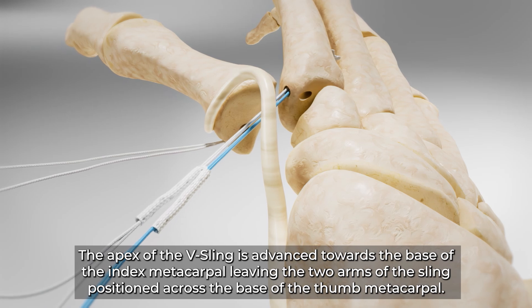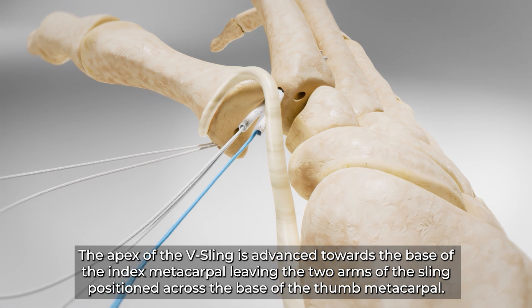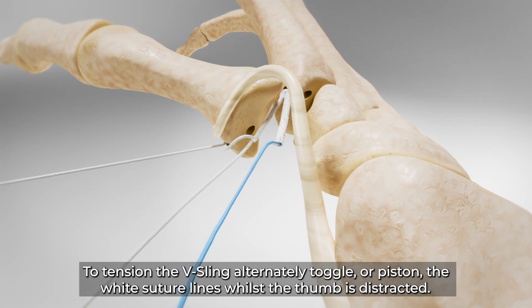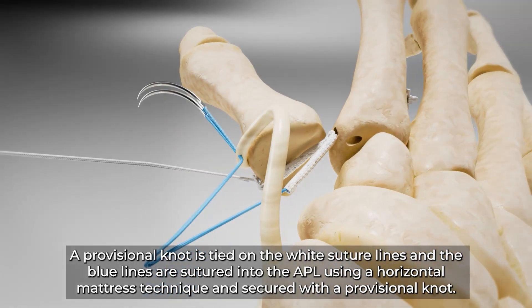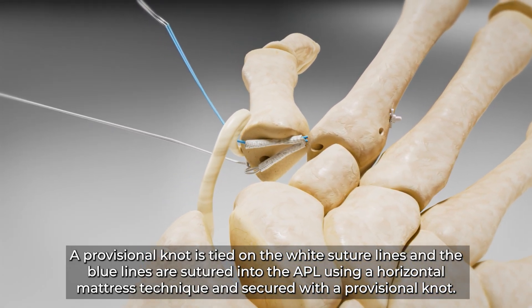The apex of the V-sling is advanced towards the base of the index metacarpal, leaving the two arms of the sling positioned across the base of the thumb metacarpal. To tension the V-sling, alternately toggle or piston the white suture lines whilst the thumb is distracted. A provisional knot is tied on the white suture lines and the blue lines are sutured into the APL using a horizontal mattress technique and secured with a provisional knot.